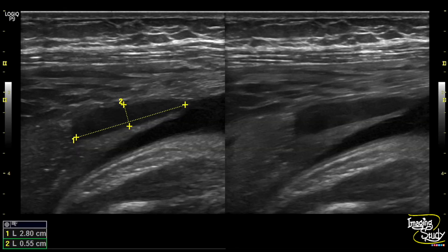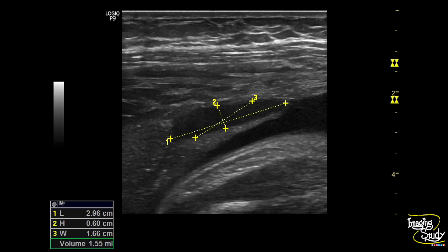Here is the picture of the hematoma. It measures about 28 millimeters by 5 millimeters, and the volume measures about one and a half milliliters.